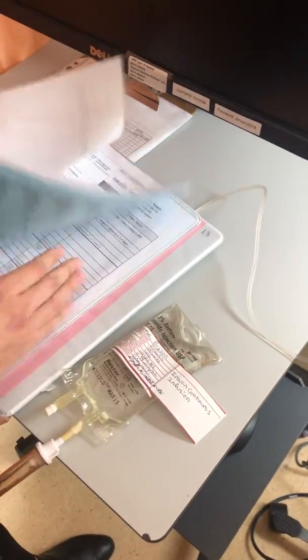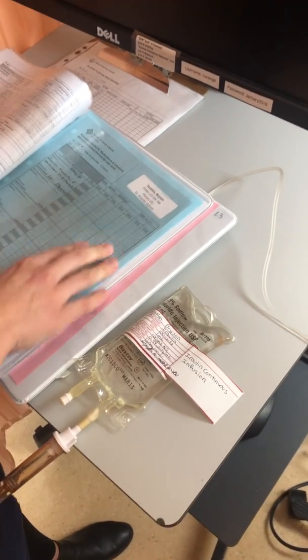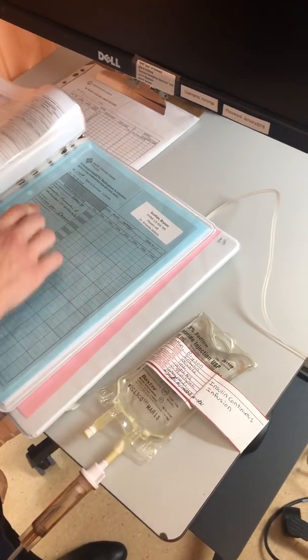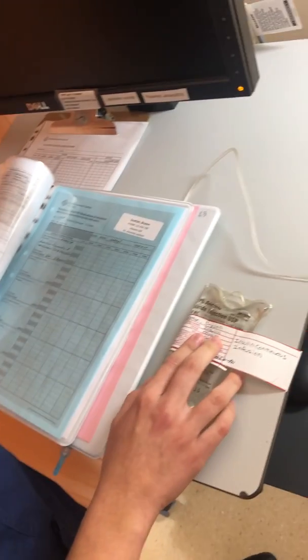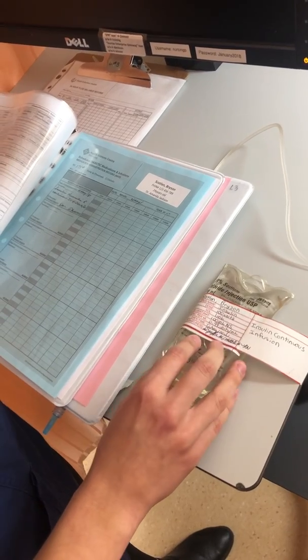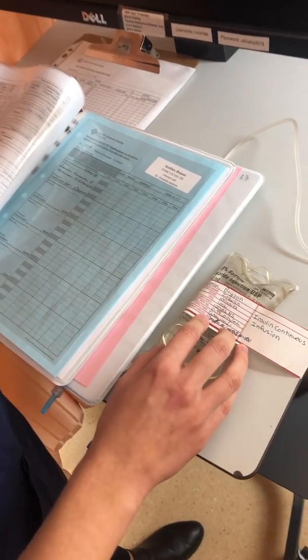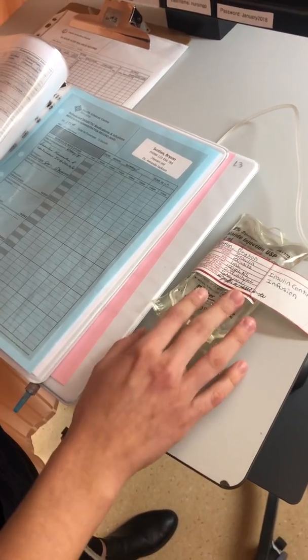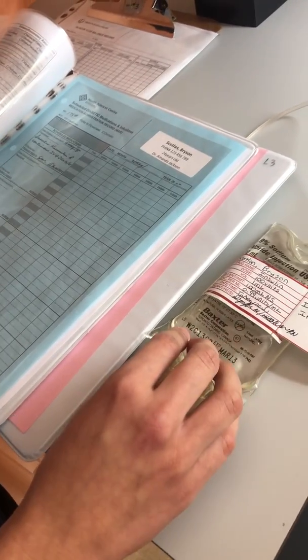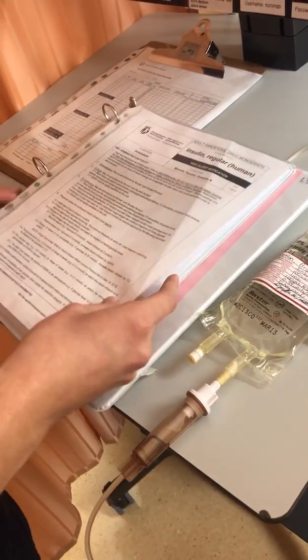So here we have right patient, Bryson Scotland, and we have right drug, insulin, Humulin R, continuous infusion, right dose. So we have 2 units per hour, continuous. Right route is IV, and right time is now. And then I'm going to look at my monograph here.